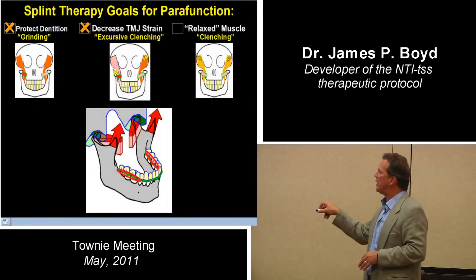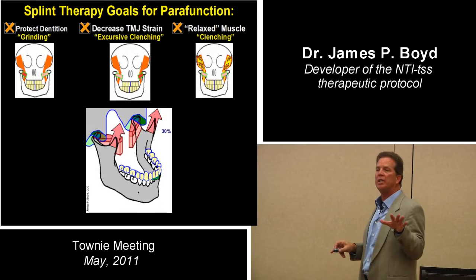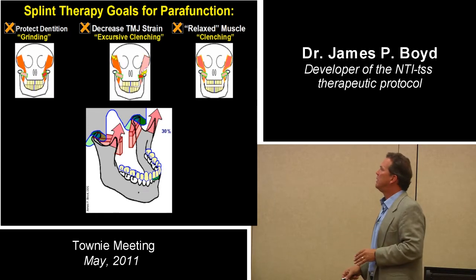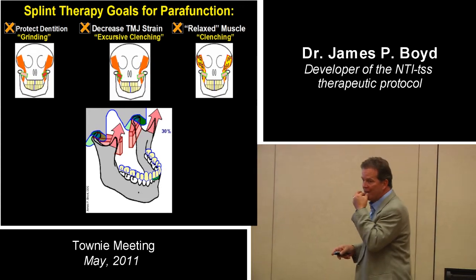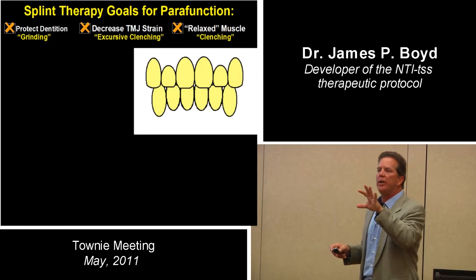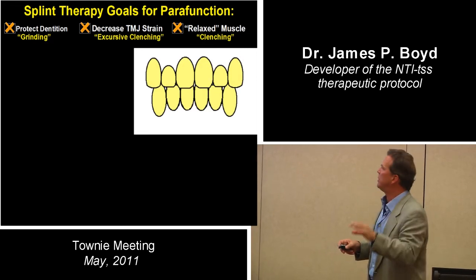Here's this incisal point contact at 30% of contraction intensity. Great NTI concept. So here's a quick synopsis about the rationale of an NTI and how it does what it does, and how you can screw it up.